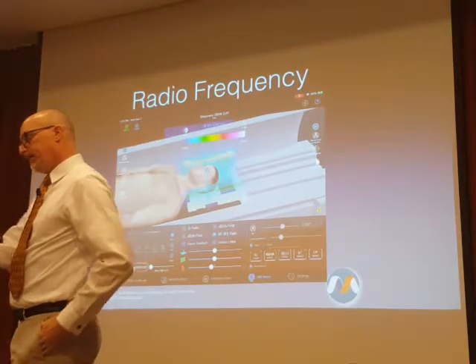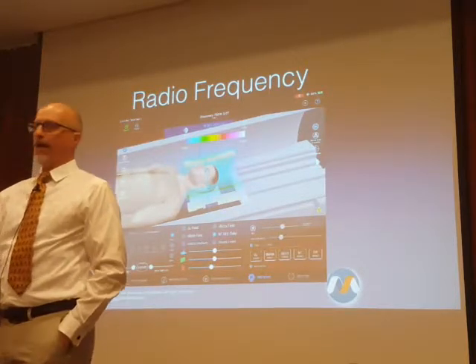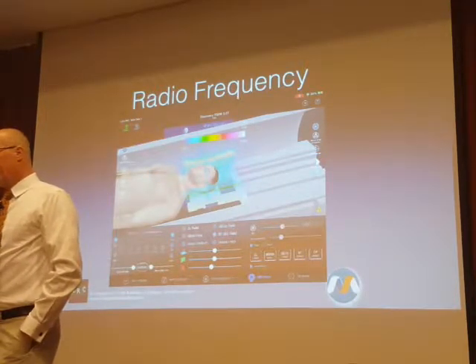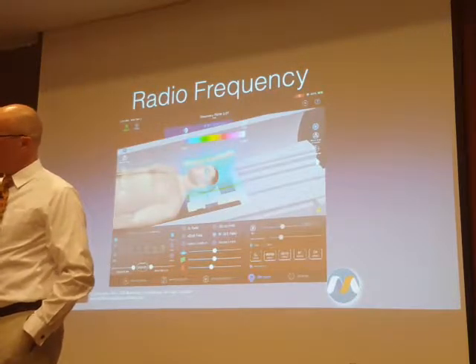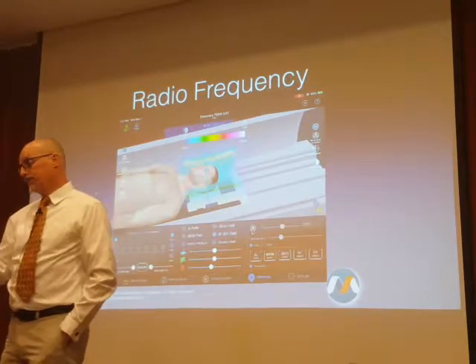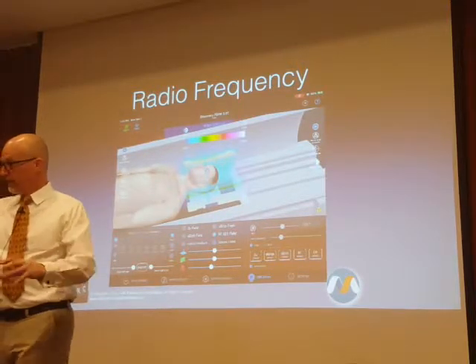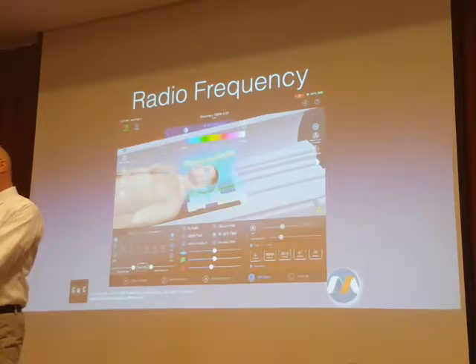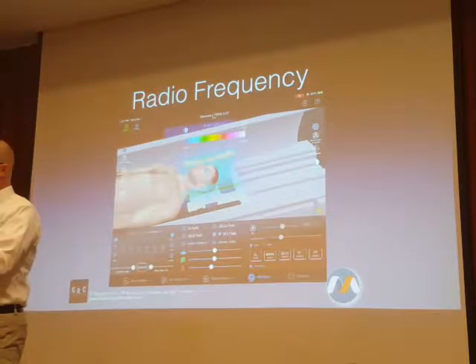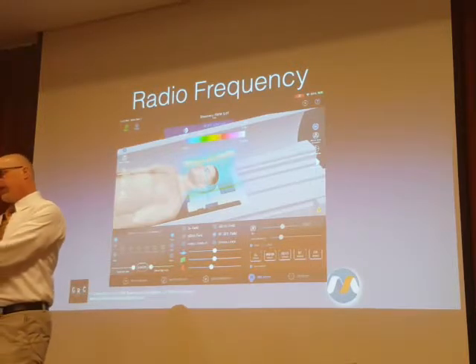If you're doing an infant that has 10 kilogram mass and the next patient weighs 100 kilograms and you do a study for each of them at 2 watts per kilogram, the amount of power is massively different, because it's 2 watts per kilogram times 10 total kilograms for the infant, times 100 for the adult. So the total power being output before we normalize for the mass of the patient is 10 times more power for the adult.